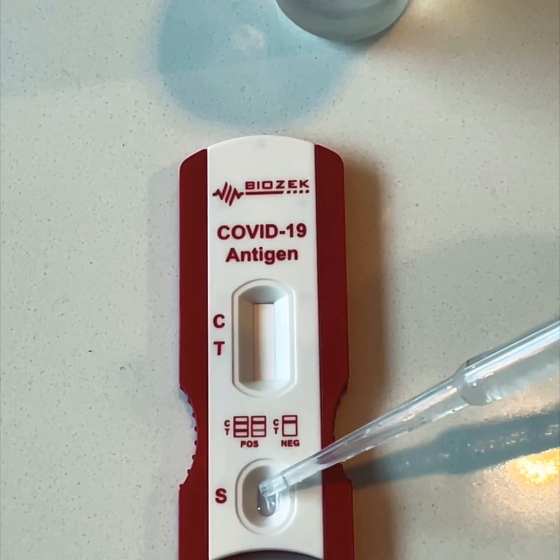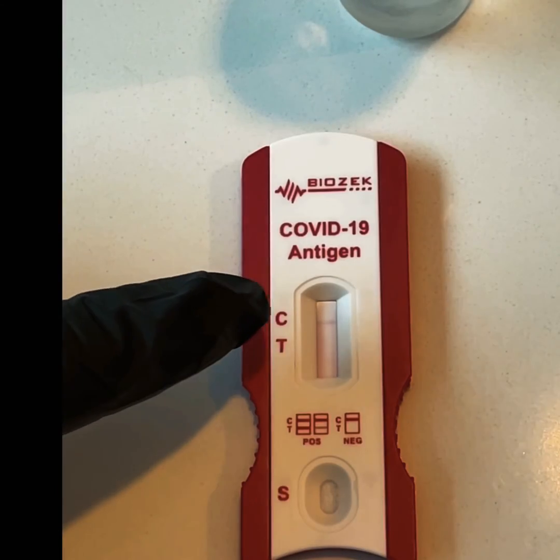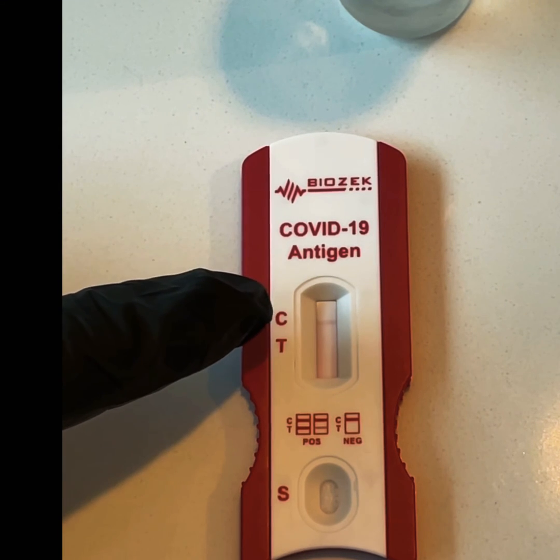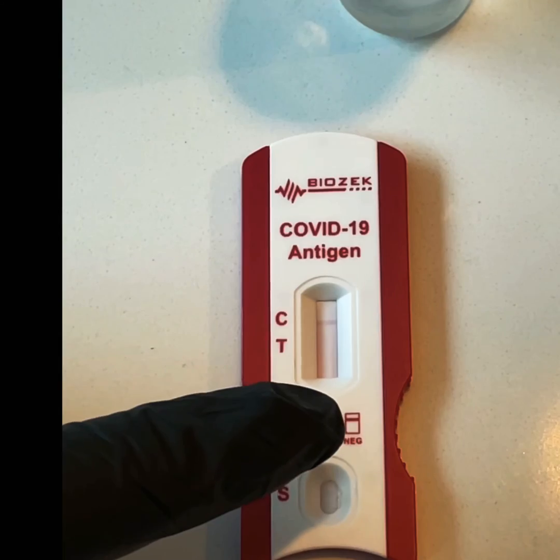Needless to say, if you do have a positive result, do seek medical advice as soon as possible and self-isolate. You can see a line appearing adjacent to the letter C, which suggests that I'm going to have a negative test result.